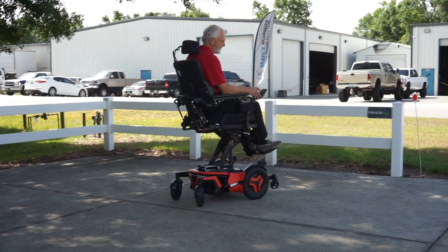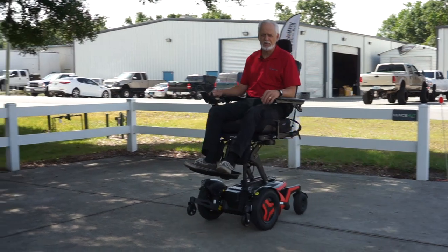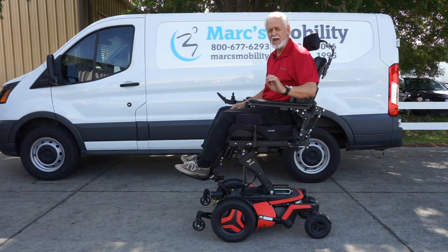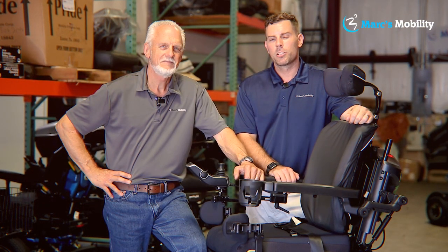With the seat elevated it drives at about three miles per hour. If you're looking for a really top-of-the-line power chair, this is the most expensive chair you can get — the latest model, the Permobil F5 VS for vertical standing, ready to go.